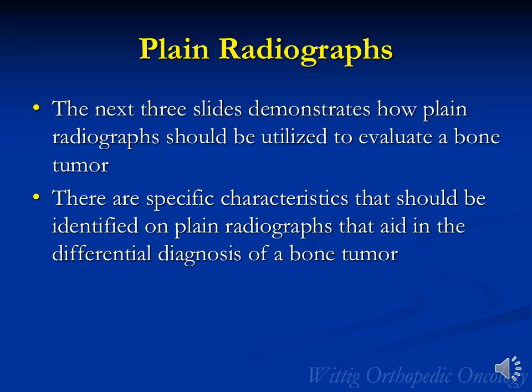The next 3 slides demonstrate how plain radiographs should be utilized to evaluate a bone tumor. There are specific characteristics that should be identified on plain radiographs that aid in the differential diagnosis of a bone tumor.